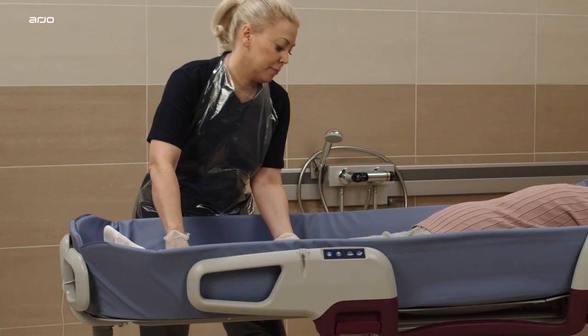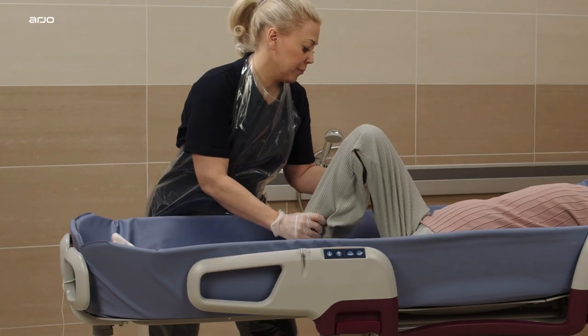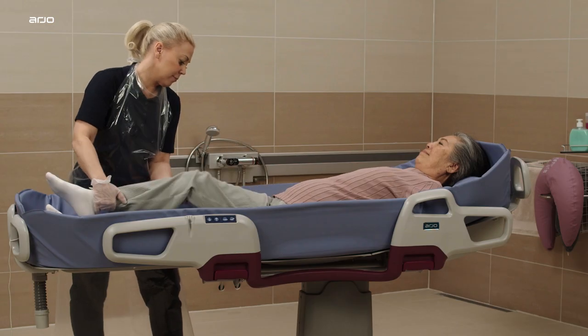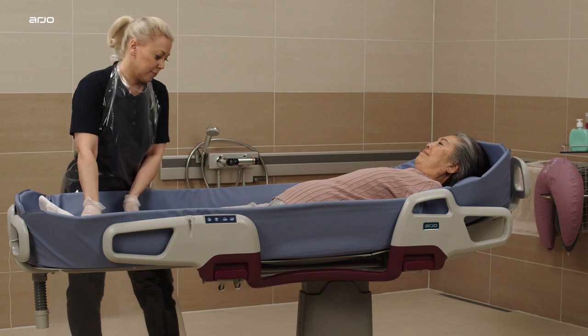Bend the patient's knee to better see if the patient's buttocks are placed correctly within the graphic outline. Align the patient's hip crease with the illustrated human figures.